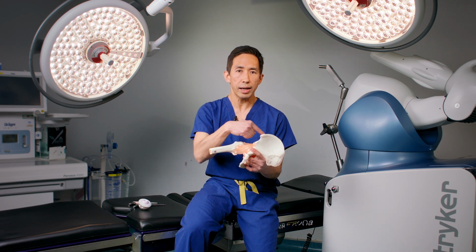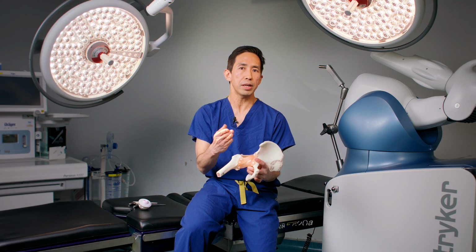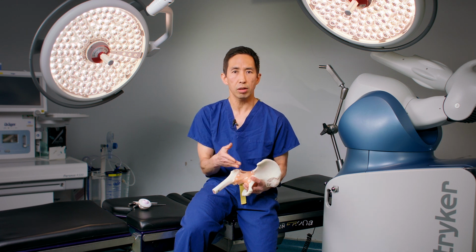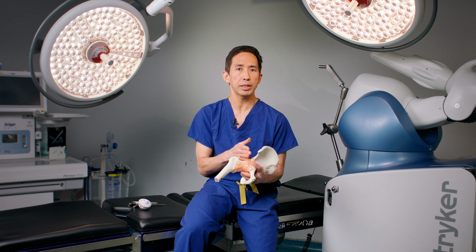For your surgeon, however, there are a few key differences with robot-assisted surgery. The 3D technology using your CT scans allows your surgeon during the procedure to visualize the best position for your prosthetic hip joint for your unique anatomy. During surgery, sensors are placed around your physical joint, which allows the software and robot to detect your joint in 3 dimensions. Your surgeon, guided by the robot, enters the joint and removes just the right amount of bone that is affected by arthritis. Your surgeon, with the technology of the robot, is able to very precisely and accurately position and implant your hip replacement.